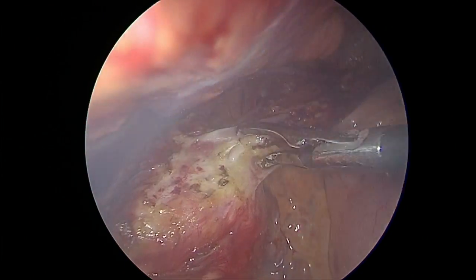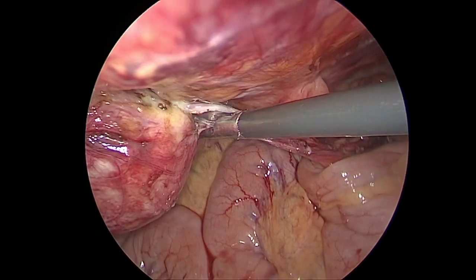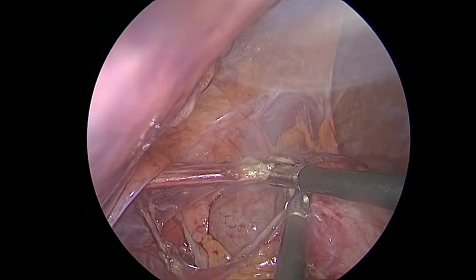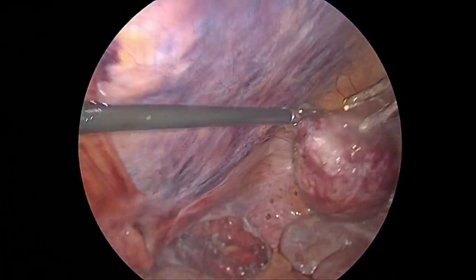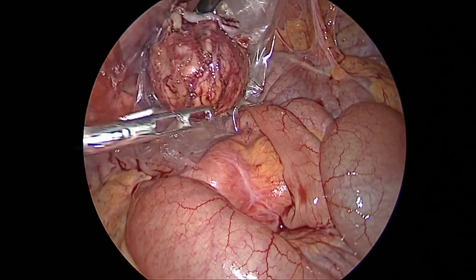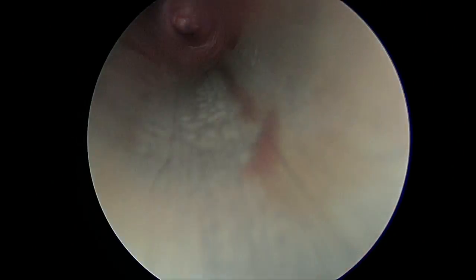So here you are seeing the enlarged cyst feeding lymphatics. So having coagulated on either side, I cut in between, bagged the specimen, and then removed it through one of the ports after aspirating the fluid, sending it for cytology.